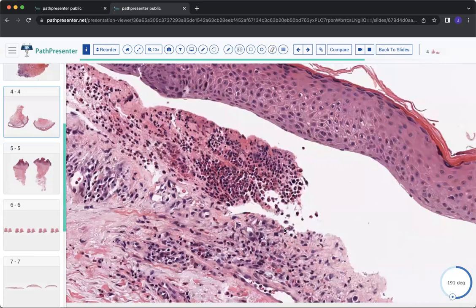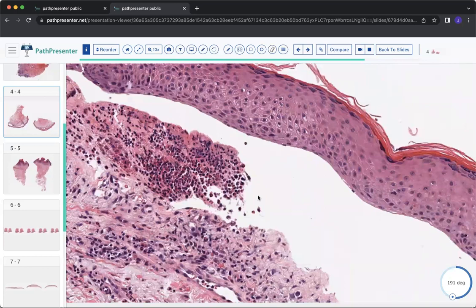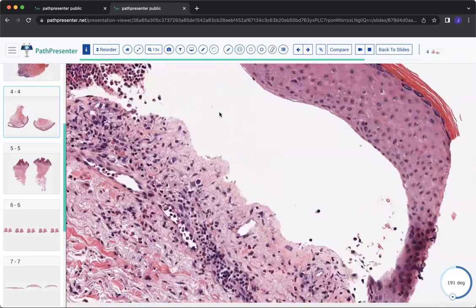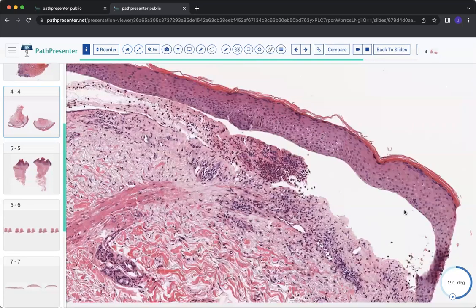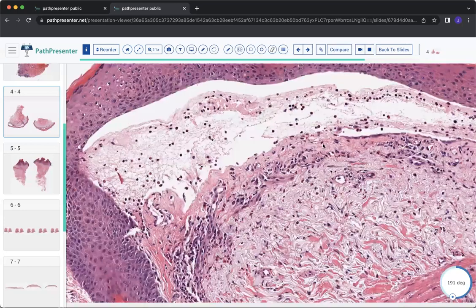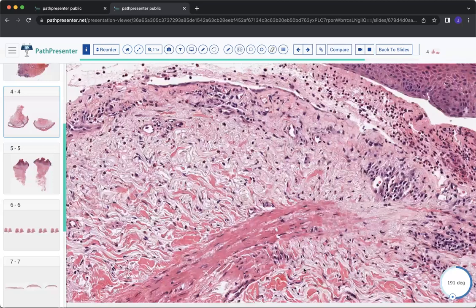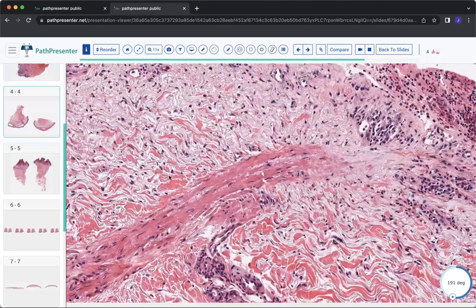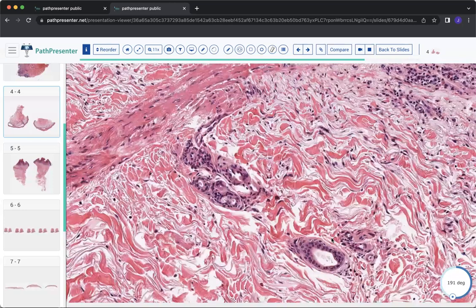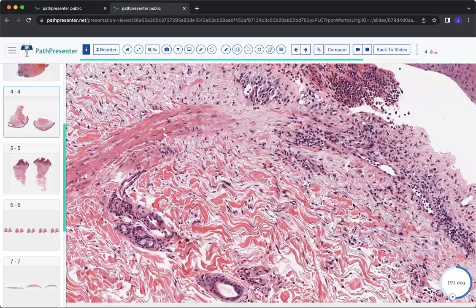If you sign this out without a DIF, you could say consistent with bullous pemphigoid if that's what the clinical was. But of course, you want to get a perilesional DIF that demonstrates dense IgG and C3 along the basement membrane. That's going to give you your diagnosis of bullous pemphigoid. And you could think about other entities here. If you had a large bulla with a lot of eosinophils and a dense wedge-shaped infiltrate where the inflammation was going all the way down, you could also entertain the diagnosis of a bullous arthropod bite, which would have a negative DIF.